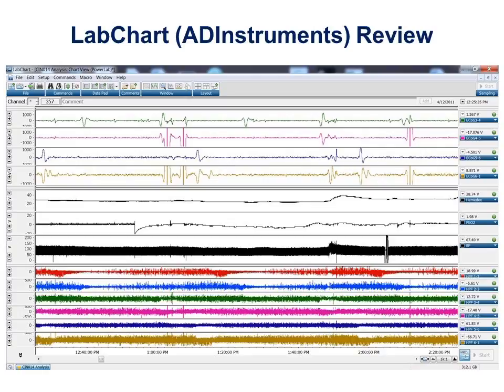For more detailed analysis, there are various software programs that you can use if your monitoring system allows you to export data in a common data analysis format like binary or MATLAB, for instance. These data can be imported into software for more detailed analysis and signal processing. And the one that's been most commonly used is LabChart, which can be obtained from AD Instruments.